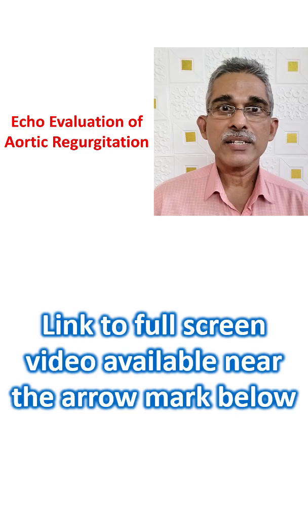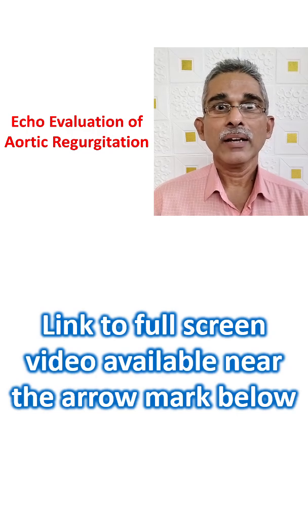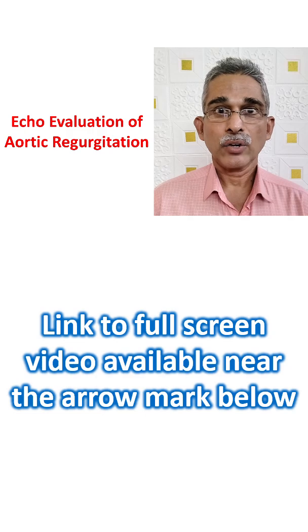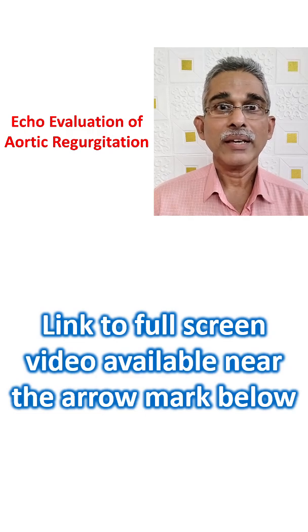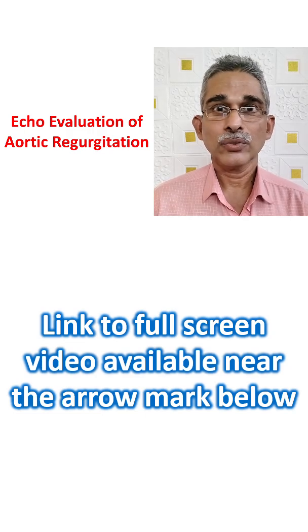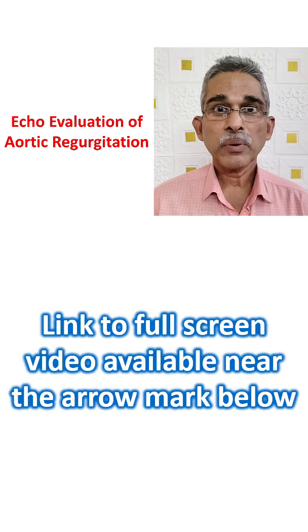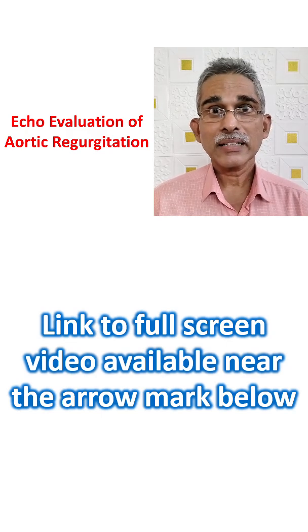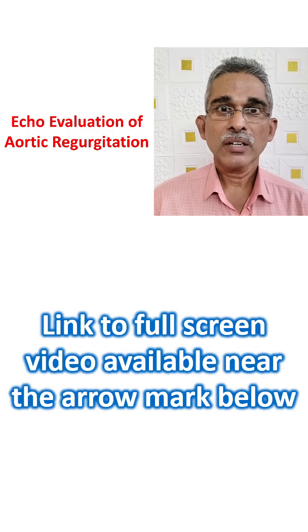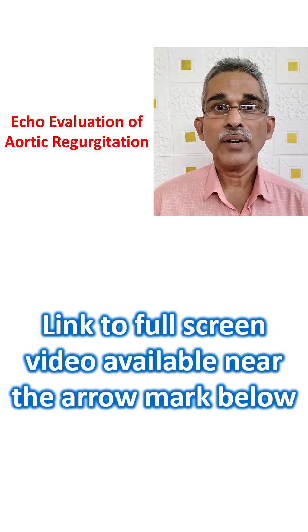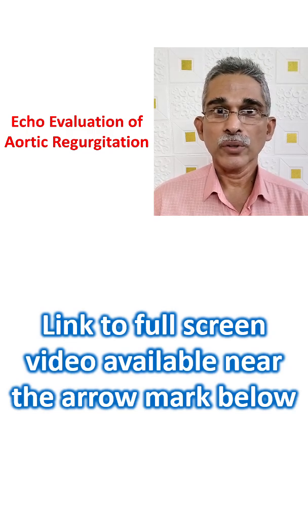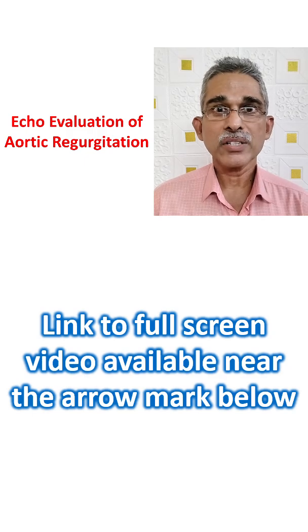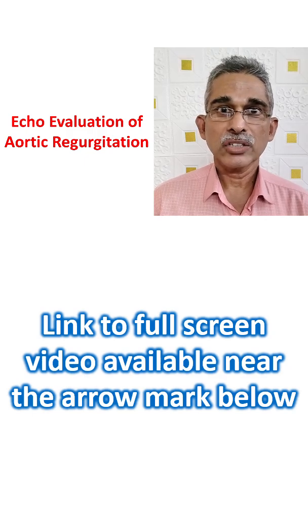Though aortic regurgitation can be evaluated well in the first view obtained in adult echocardiography, usually the parasternal long axis view, multiple views are desirable because an eccentric jet of aortic regurgitation may not be seen to the full extent in a single view. That is why we need multiple views for evaluation of aortic regurgitation.